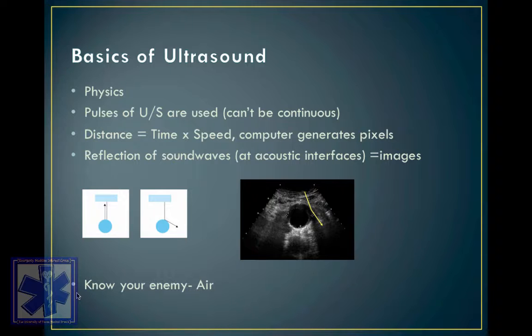It's going to send that sound wave down. It's going to register all this tissue here, subcutaneous tissue, and bounce back a little bit. And then when it hits this aorta right here, that difference in the mediums between the two tissues will send back some to the probe. That will give you the image right there.